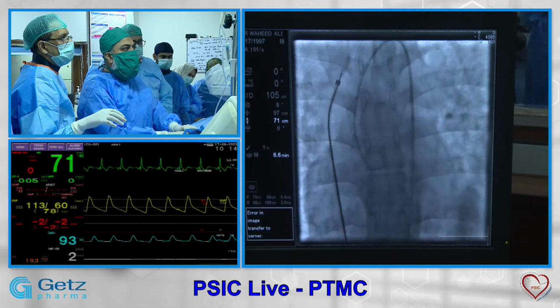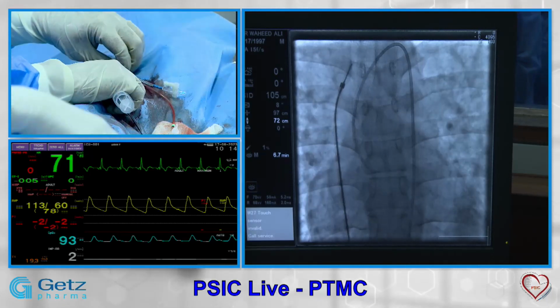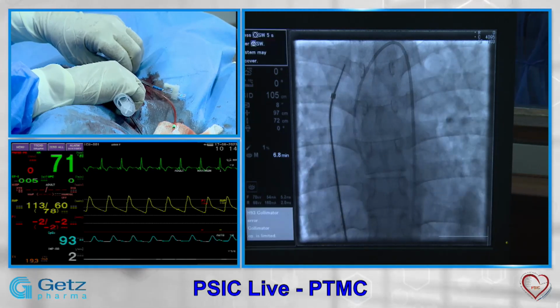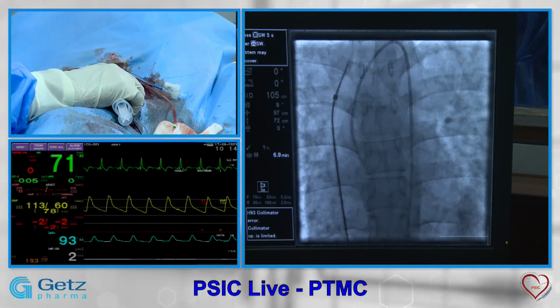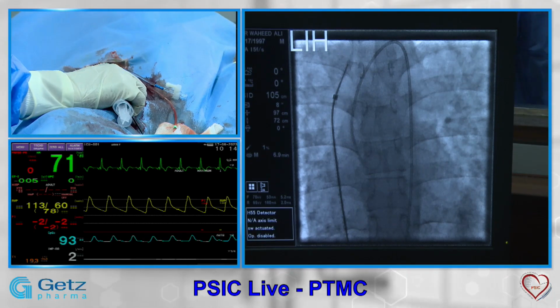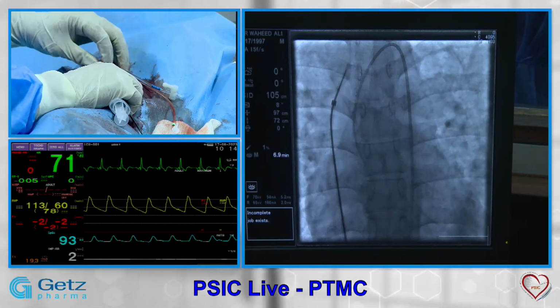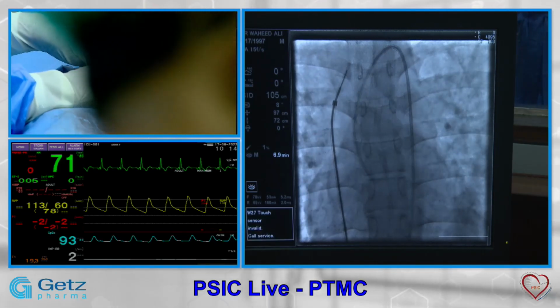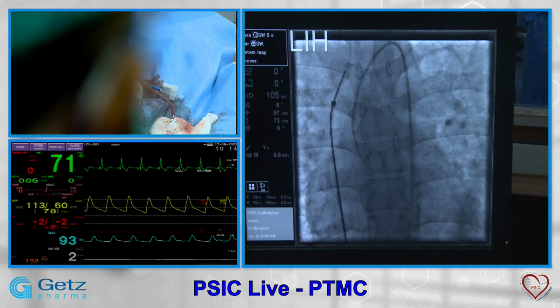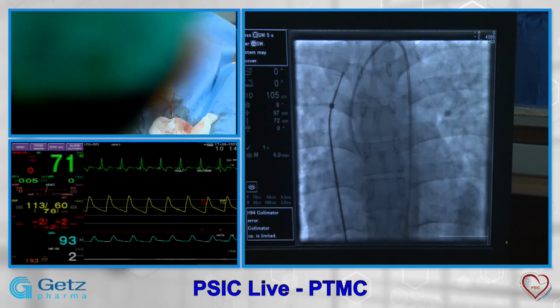So the needle goes in, and one important thing is the distance between your needle and the distal end of the dilator. The distance should not be very close and should not be very far. This is an important point we will be discussing in the complication part, as it has some complications. So we need to be careful. Sometimes a junior person is doing it and they are afraid of taking the needle further away. They take a larger distance between the two, and that's why they have some problems.